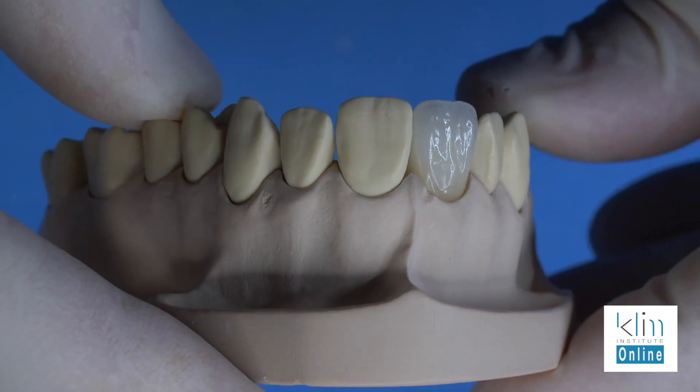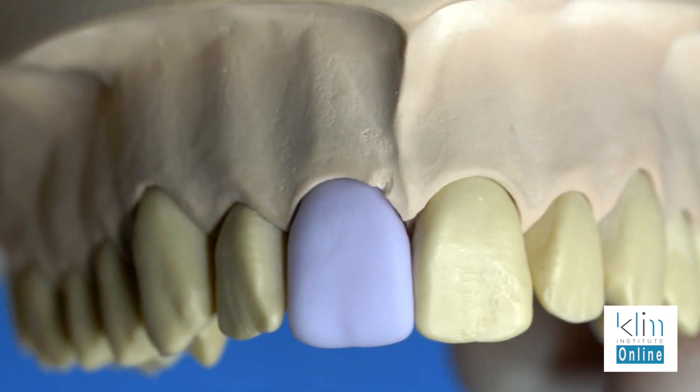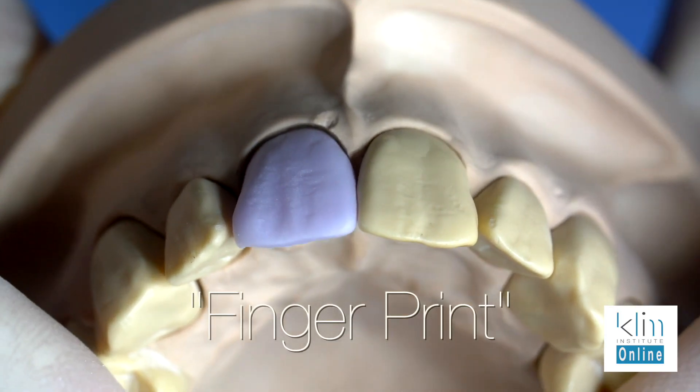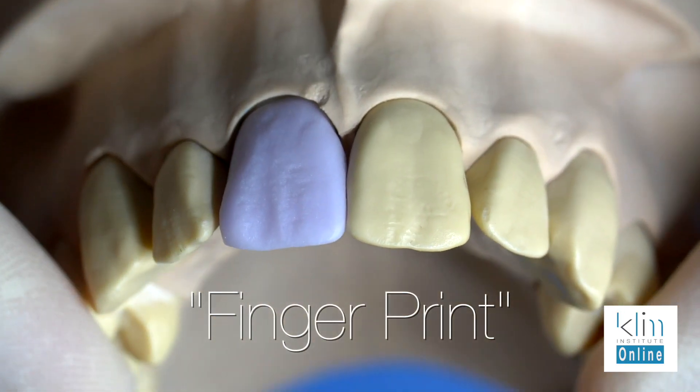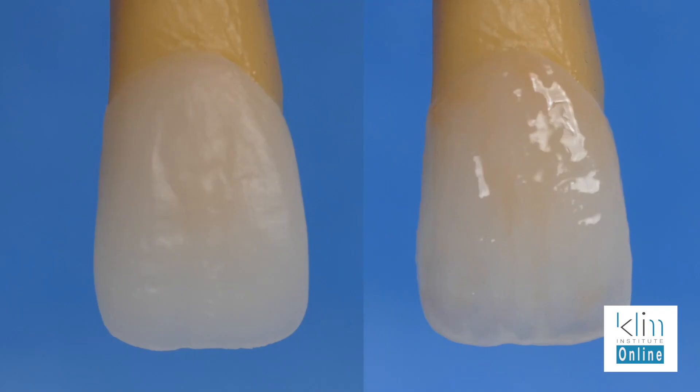Let's review how we got here. We diagnosed the case — we looked at the biofunctional activity of the mouth, the patient's expectations, and the clinical situation, and we restored the teeth. We used copy and mirror for our digital design, particularly within our CEREC system. We milled this out in emax — there are other materials you can use as well. We went through the shaping of the emax to get that fingerprint — we want to put the texture into the ceramic — and then we finished the ceramic. In this case, we used Mio with a combination of their coloring and structure system. Now we're ready to polish.